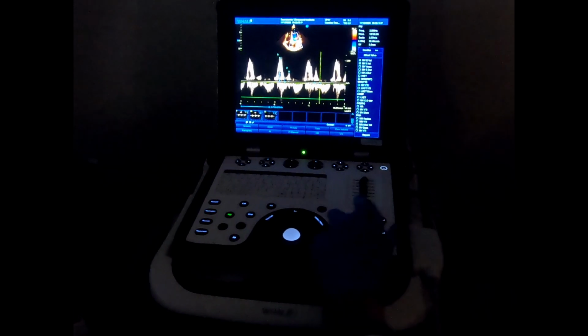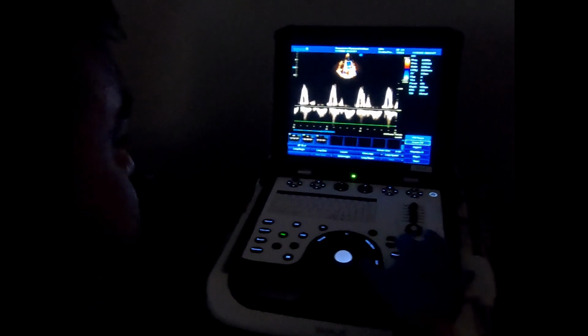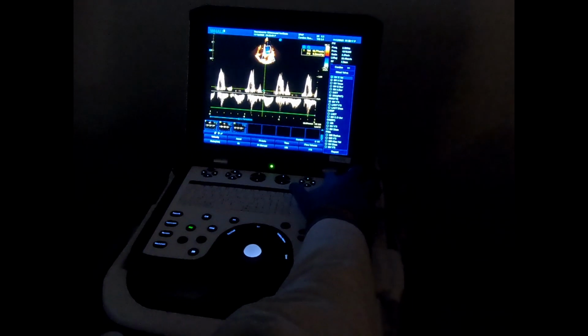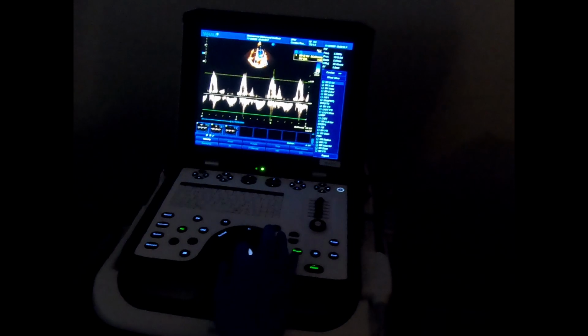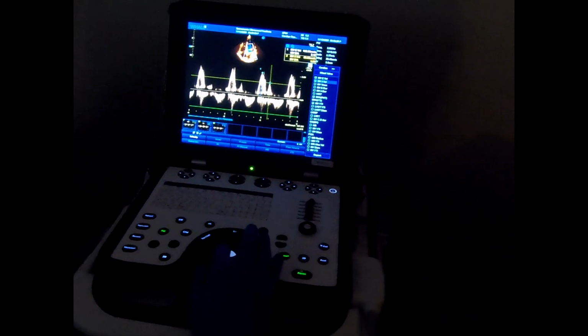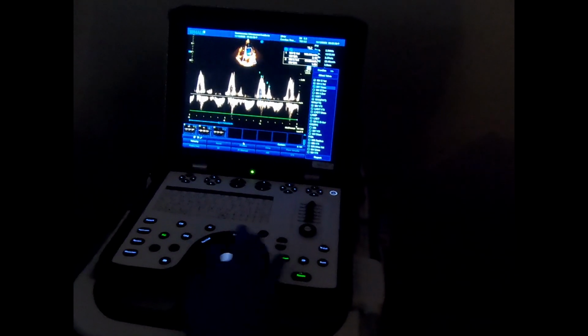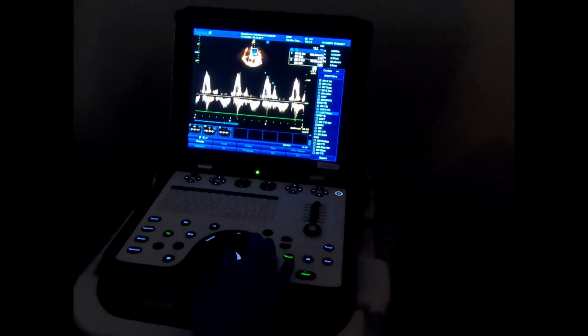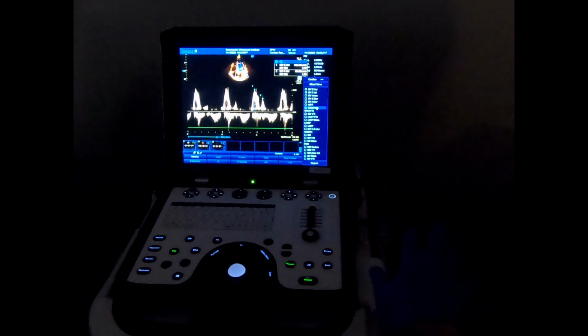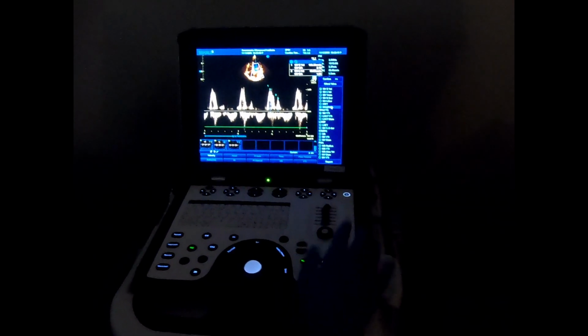Why do you prefer the A duration in the same beat? I prefer all the measurements to happen in the same beat. So just to set a good example, I would suggest going with the same. See, this is not highlighted, not active. If this is not active, then you only have this option to go. The problem is with these machines' packages. Once you go to the clinical site, you will see all the packages in order, and it's always there.